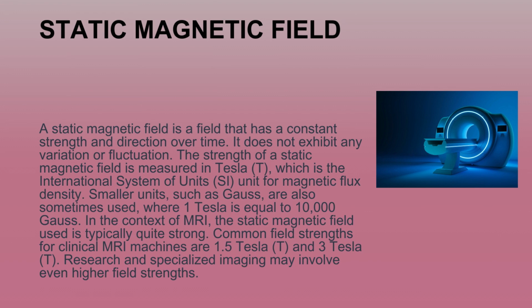In the context of MRI, the static magnetic field used is typically quite strong. Common field strengths: most of the hospitals are using 1.5 Tesla, and some of the hospitals extend to 3 Tesla. Research and specialized imaging may involve even higher field strengths.